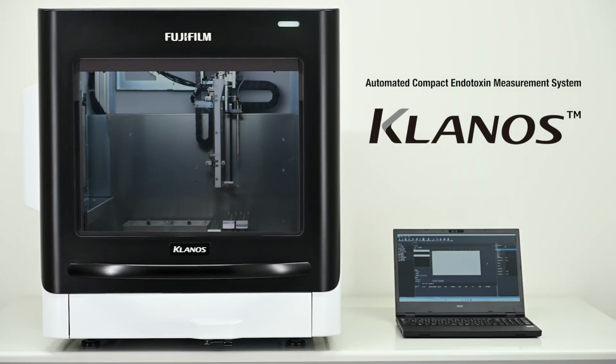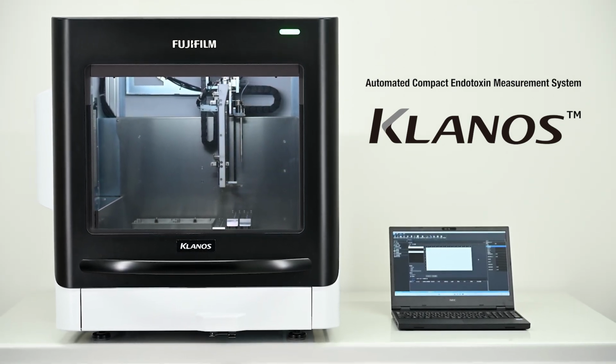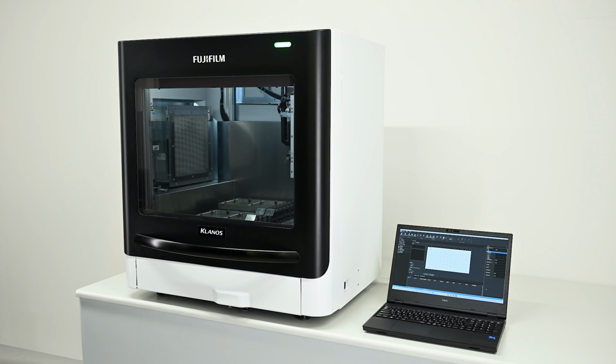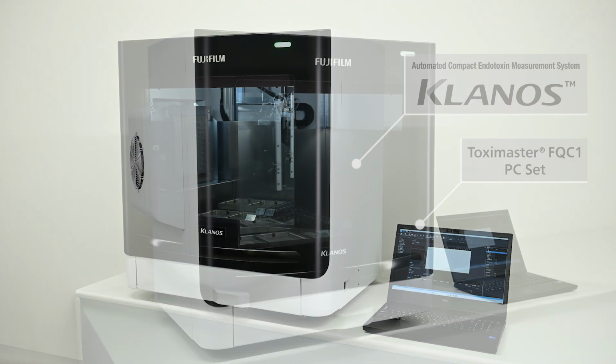Automated Compact Endotoxin Measurement System KLANOS is an automated system specialized for endotoxin testing. This system consists of the main unit, the dedicated software Toximaster FQC1, and a control PC.